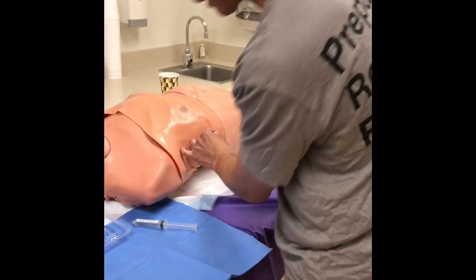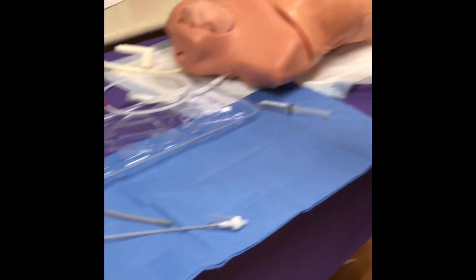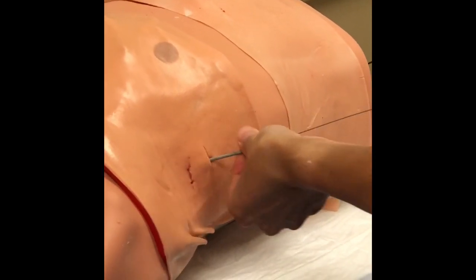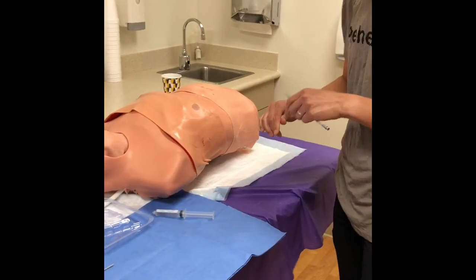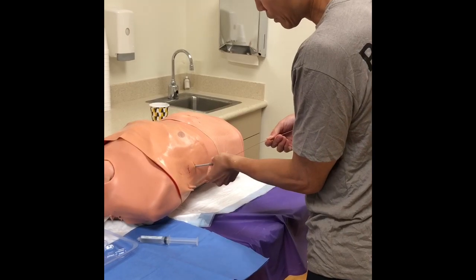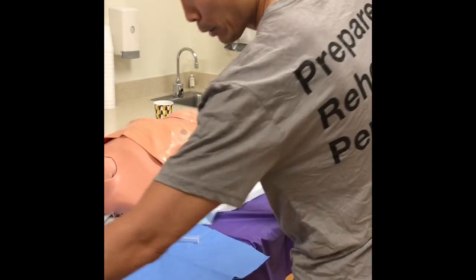Once you're in, keep the wire static, pull off the needle and the guide cap, then dilate. You've got a series of dilators in the kit. If you have time and the patient is premedicated, use the dilators sequentially, giving a little twist as you go in. There may be some fleeting resistance — don't get scared. Dilate with the next one, sequentially using larger and larger dilators.